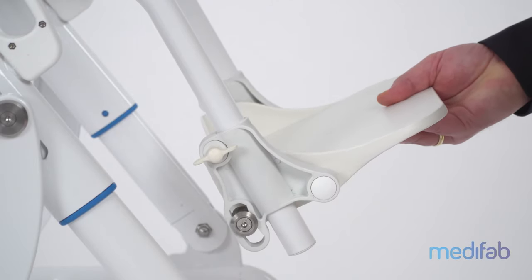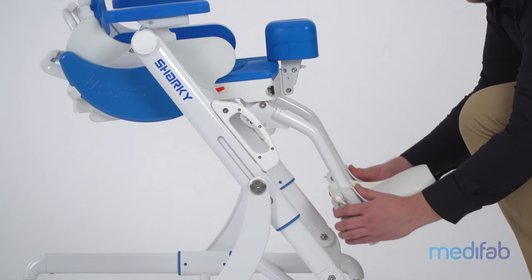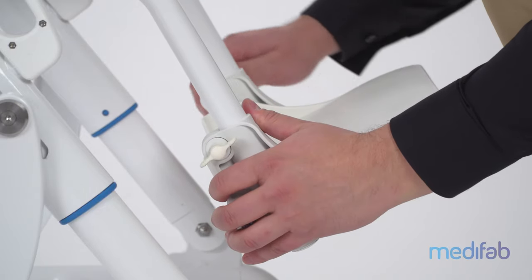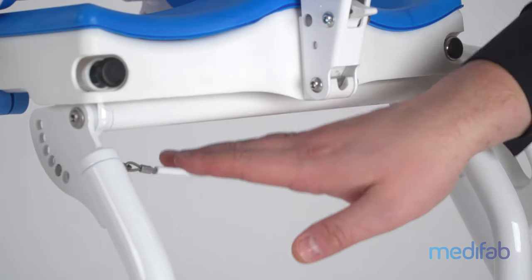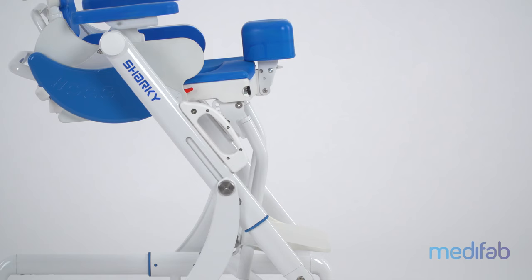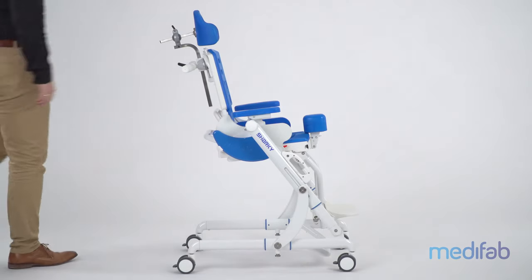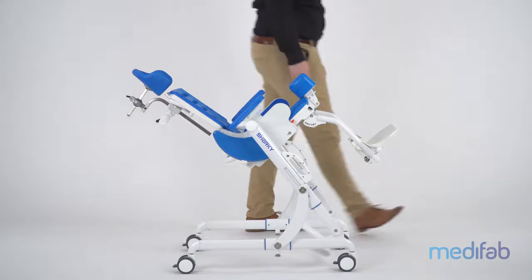The foot board is adjustable in angle as well as adjustable in height. Six knee angle positions between 78 degrees and 138 degrees are possible to accommodate varying knee angle requirements. The foot rest hanger is attached to the seat and can be removed quickly and without the use of tools.